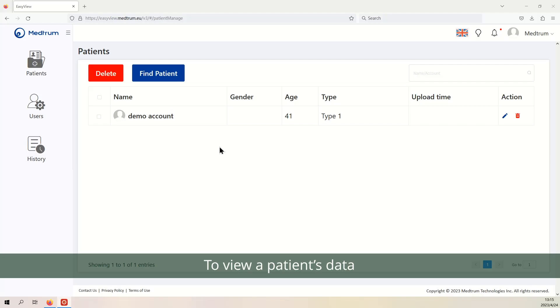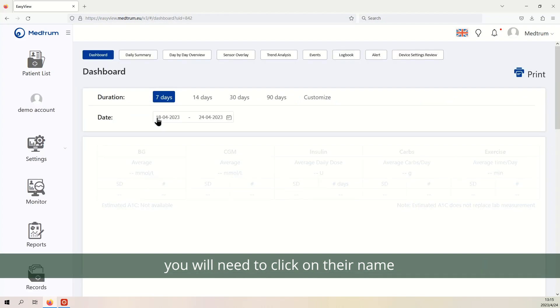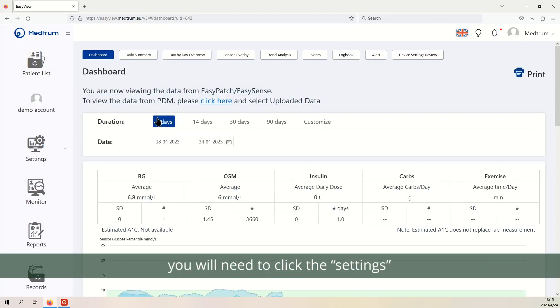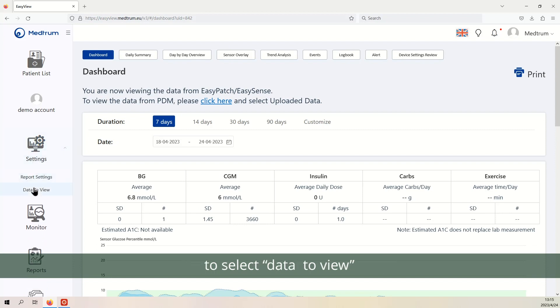To view a patient's data, you will need to click on their name. From here, you will need to click the settings tab on the left of your browser page to select data to view.